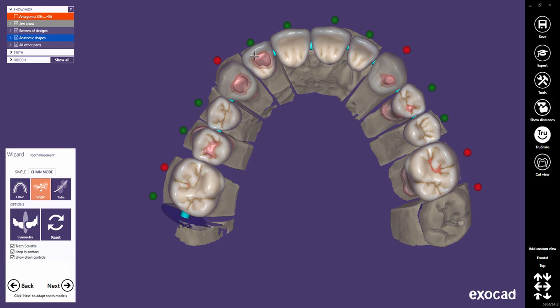And to finalize the arch setup. The chain mode is a great tool to do a full arch tooth placement. A few clicks are enough to do such a setup.